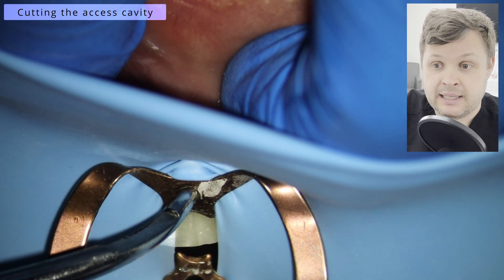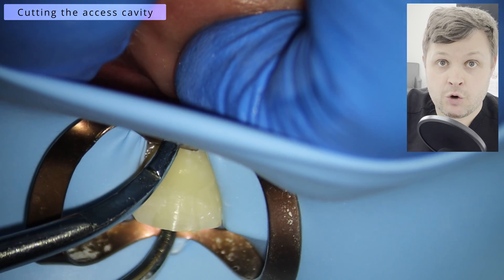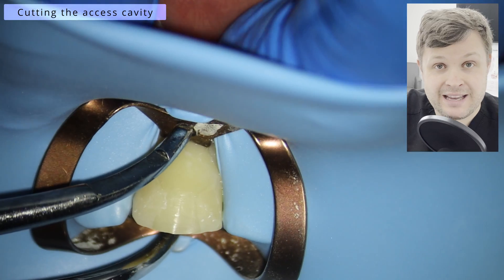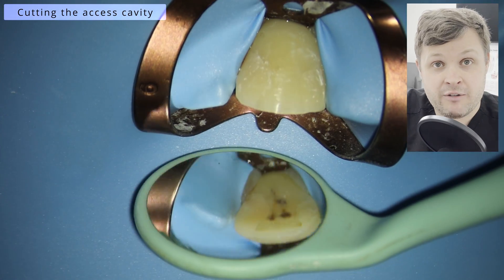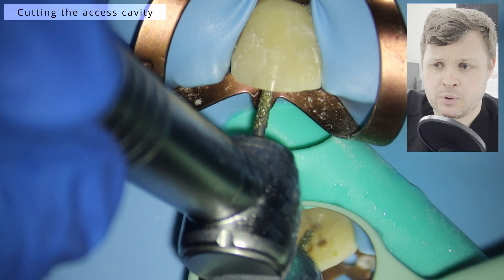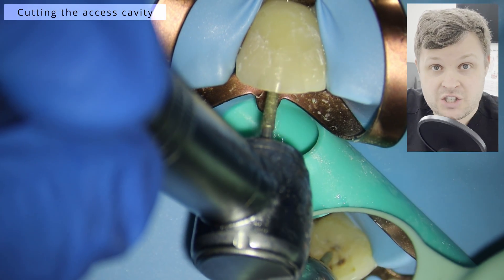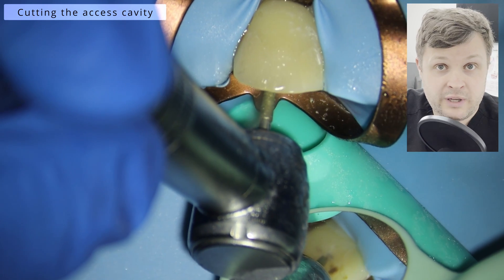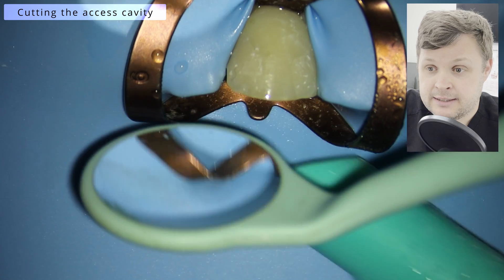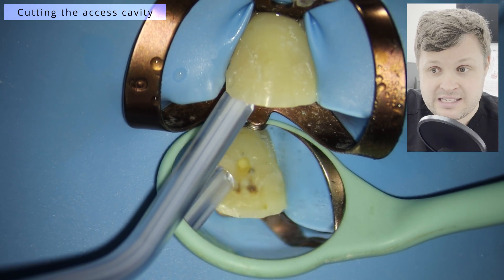Now we're ready for the root canal. We're going to place rubber dam, and I don't care what anybody says — no rubber dam, no root canal. That's really important, mainly for patient safety and also to stop the ingress of bacteria inside the tooth. Sometimes patients don't like the rubber dam and we have to tell them the treatment can't be carried out without it.